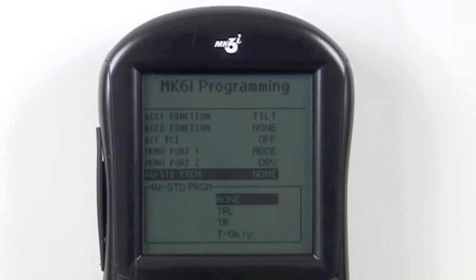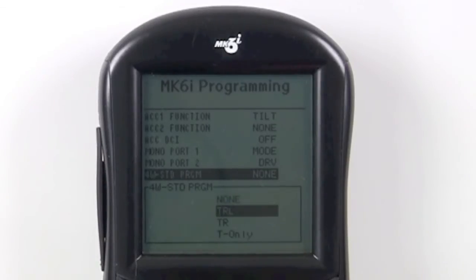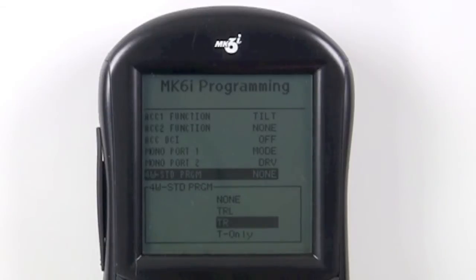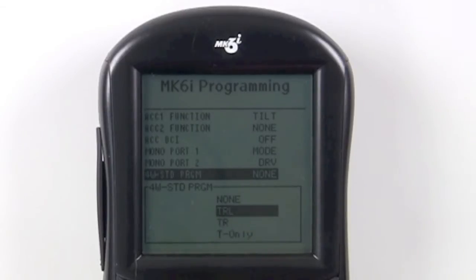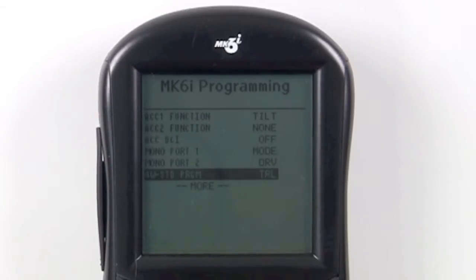The abbreviations used are pretty straightforward. TRL is tilt, recline, and legs. TR would be for a system with tilt and recline only, tilt only, and so on. Select a configuration of the chair — or in this case tilt, recline, and legs — and press select.